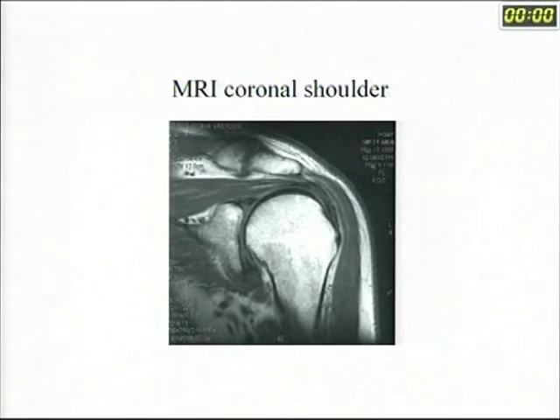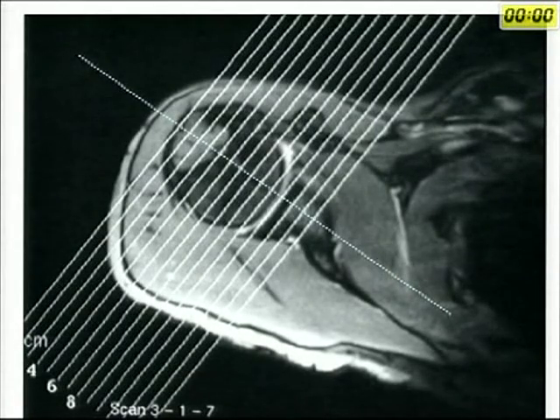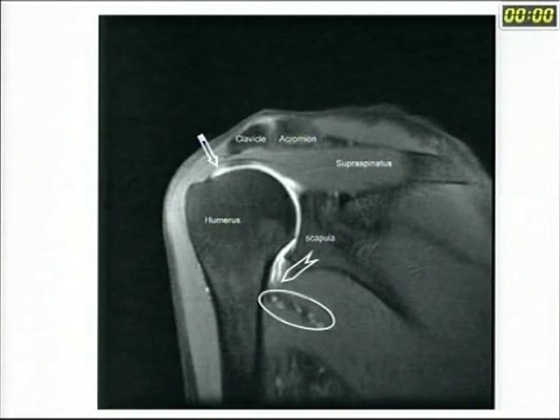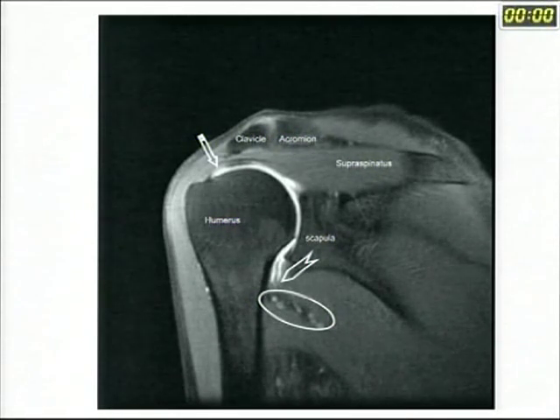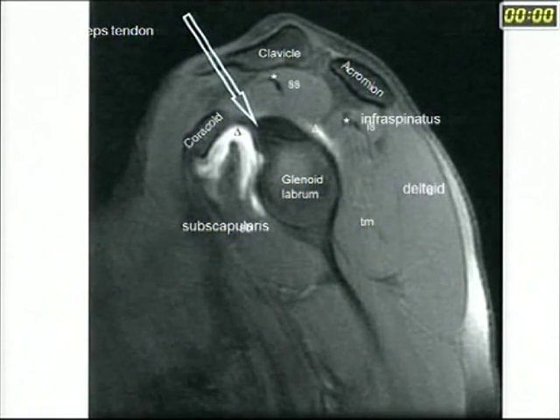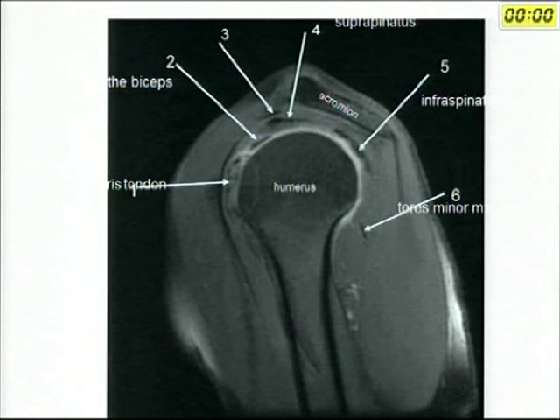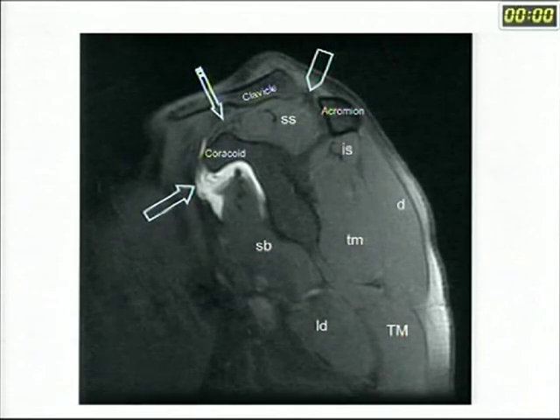This is how an MRI of the shoulder looks — coronal and axial images. When doing MRI of the shoulder, we take oblique coronal scans because we have to image in the plane of the supraspinatus, perpendicular and parallel to the glenoid. These are called oblique scans. You can see the acromion, clavicle, supraspinatus, infraspinatus, the neurovascular bundle of the shoulder, the humerus, the glenoid, the bicep tendon, the acromioclavicular joint, and the subscapularis on these images.